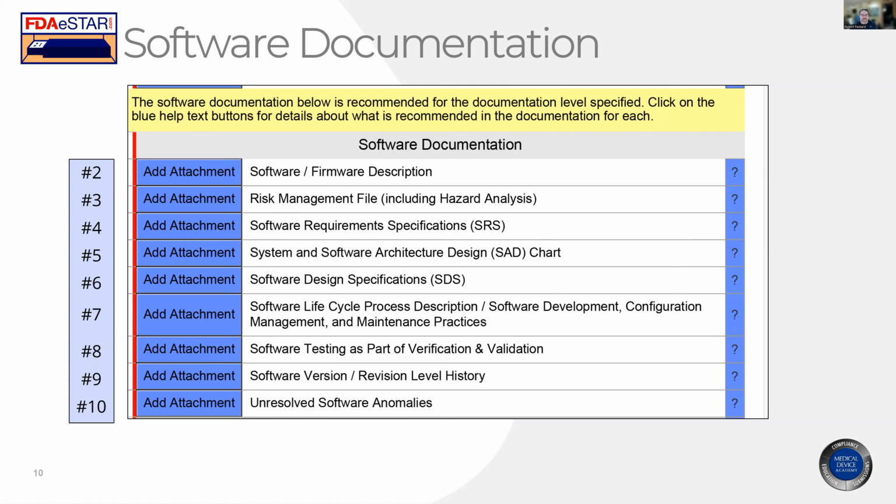So you may have to do a screen capture to show it, or you may have to attach a justification explaining it can be found in some other document. But our advice to you is break it up into the separate documents, and that's how we've written our software validation procedure. SYS 44 has a bunch of different templates for the different requirements the FDA wants you to attach. So if you follow our system, all you have to do is attach our different templates, and that's what I'm going to walk you through.